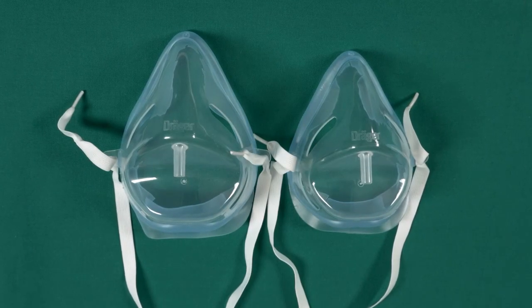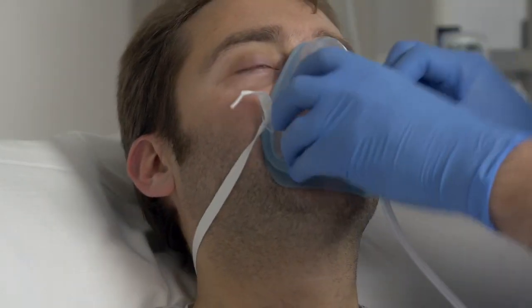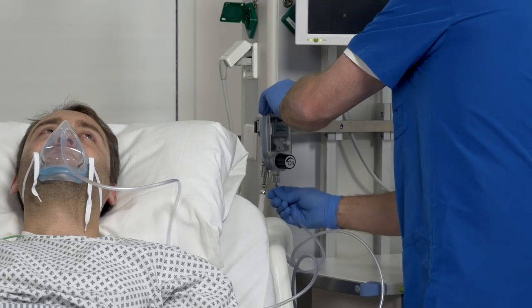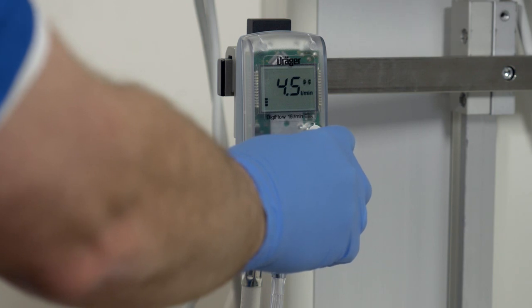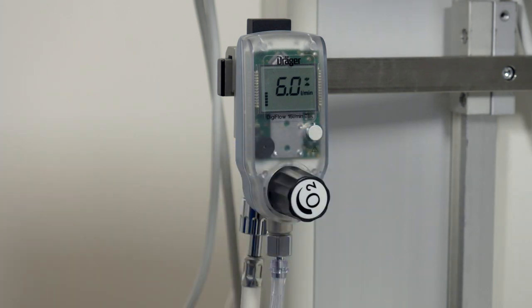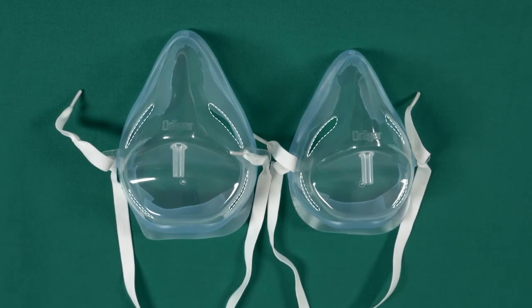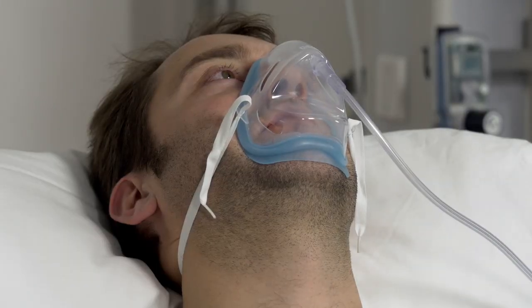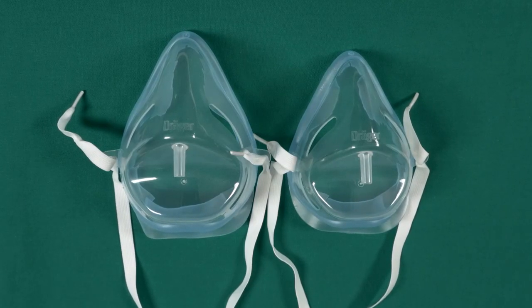If a higher oxygen concentration is needed, the medium concentration oxygen mask is a good choice. Place the medium concentration oxygen mask on the patient, check if it is fitted correctly, and connect the mask to the flowmeter with the connecting hose. Then set the desired flow. The medium concentration oxygen mask is operated with a gas flow of 5 to 8 litres per minute and provides an oxygen concentration of 35 to 50 percent depending on the selected gas flow. The supplied 100 percent oxygen is mixed with ambient air via the slots in the mask. The actual values of the oxygen concentration depend on the patient's breathing pattern. All our oxygen masks come in two different sizes for an ideal fit.